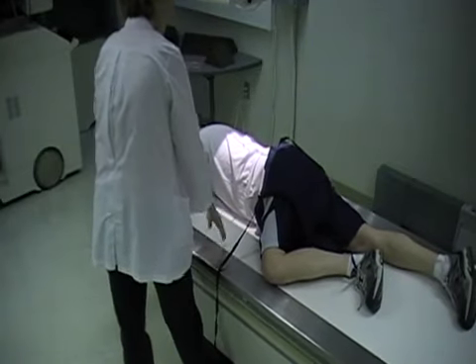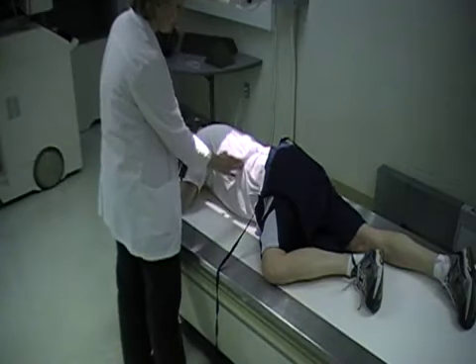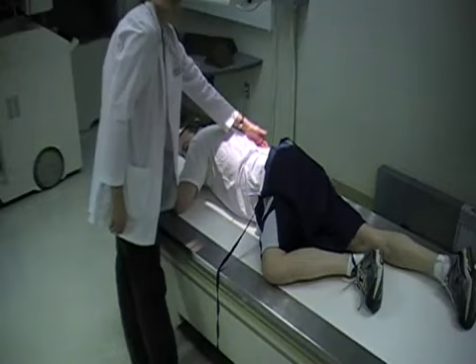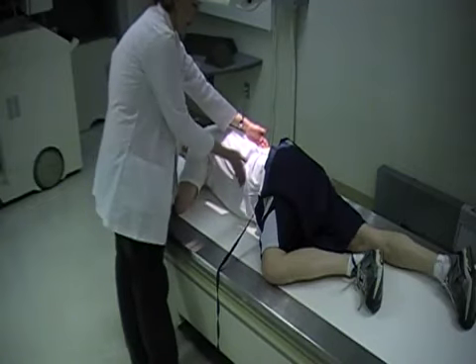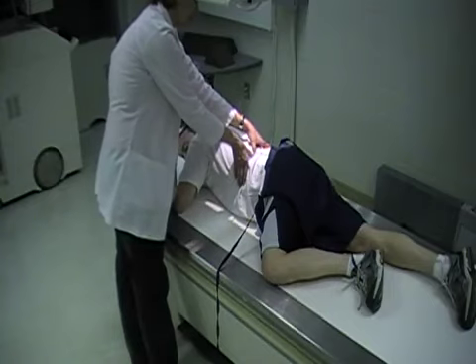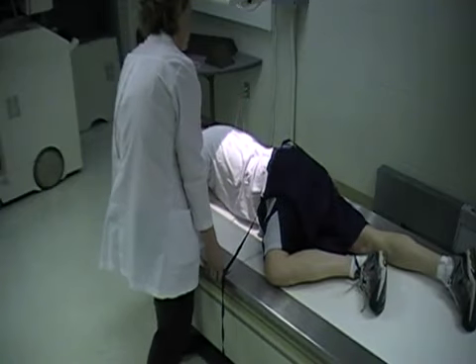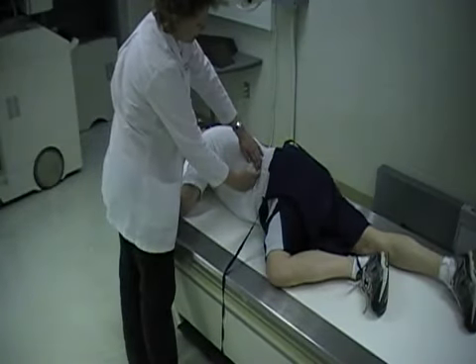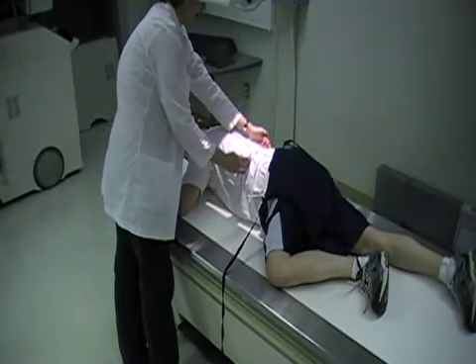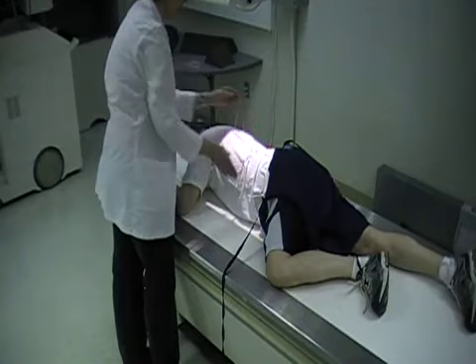Positioning for the stomach, again, feel that bottom border of the rib, and you're going to come up 1 inch to 2 inches. Palpate the actual spine and the lateral edge of the body, and you're going to go halfway. Those are 2 landmarks you have to watch out for. Bottom edge of ribs, come 1 inch to 2 inches up. Palpate the spine and this lateral border. You're going to go halfway.